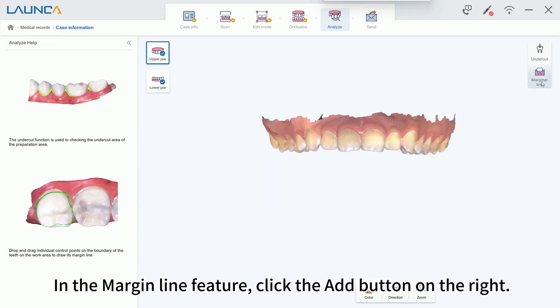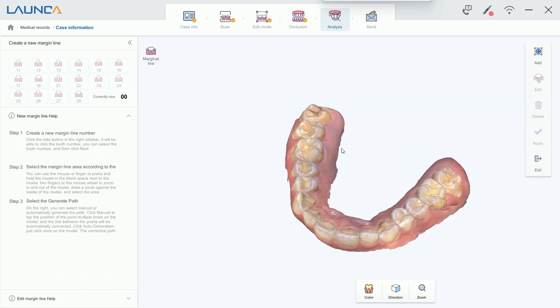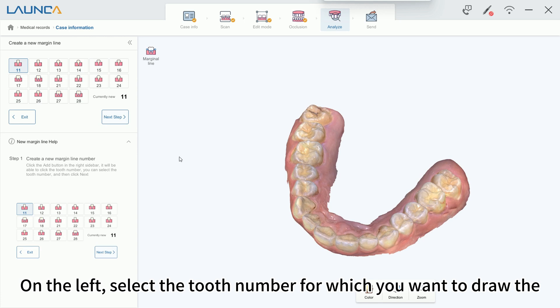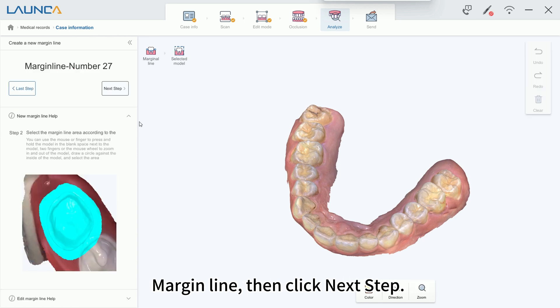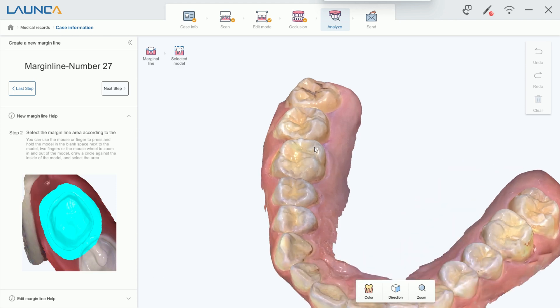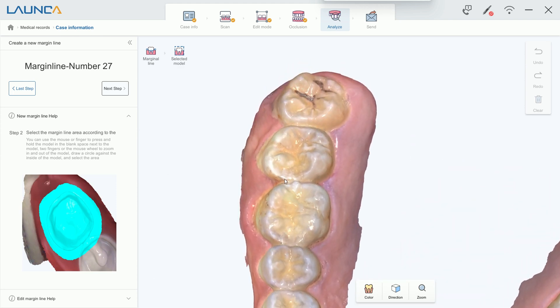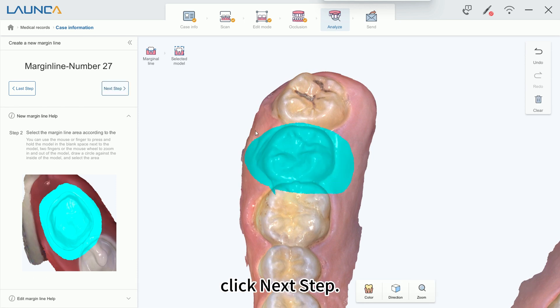In the Margin Line feature, click the Add button on the right. On the left, select the tooth number for which you want to draw the margin line, then click Next Step. Click the mouse button and select the range of the respective tooth, then click Next Step.